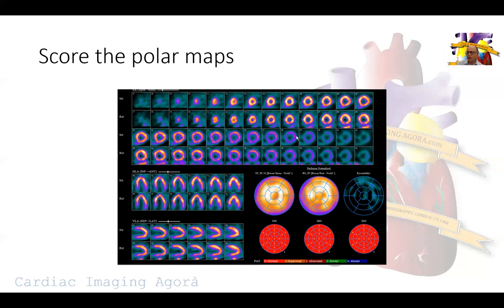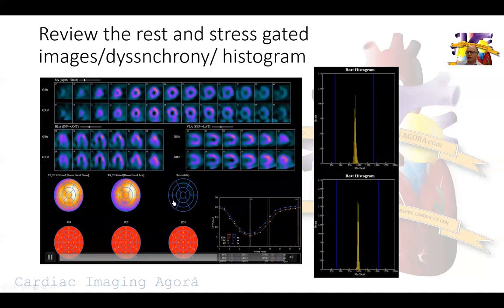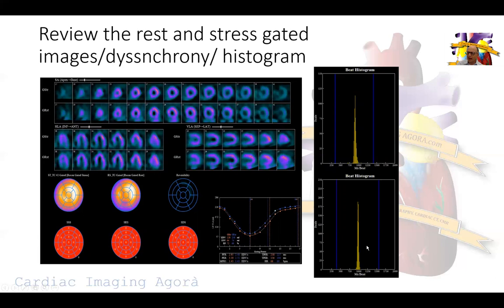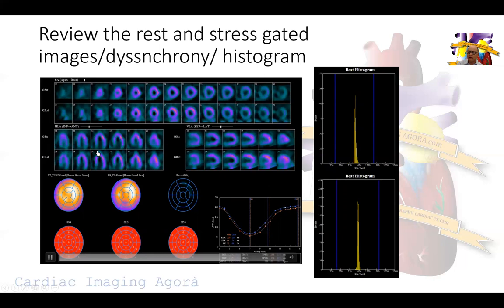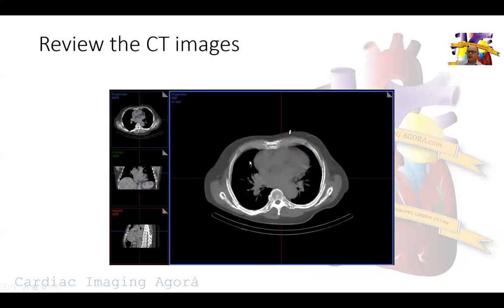We go back to the gated images in the traditional fashion. We look at the histogram for rest on the bottom, stress on top. There is not much ectopy here to talk about. Ejection fraction is normal, volumes are normal, complete normal contractility of all chambers including the right ventricle, as you can see in the horizontal long axis.